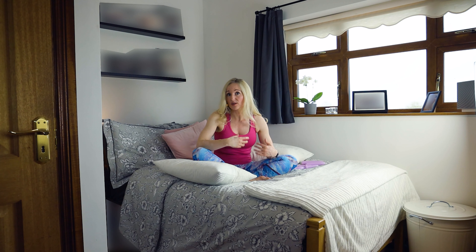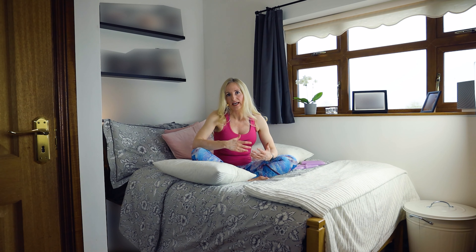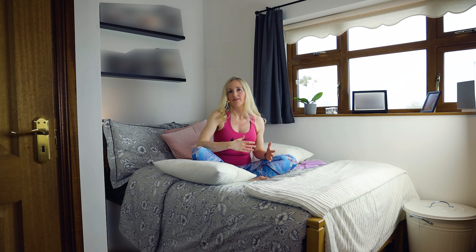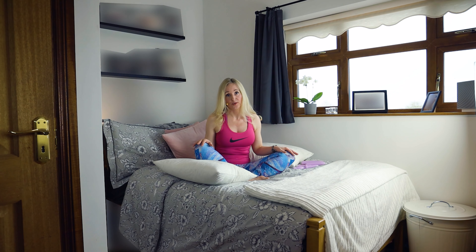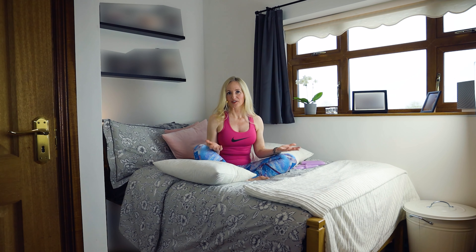Take your time. Be as relaxed as possible. If you want to try penetration, make sure you're with somebody who makes you feel safe and that you're in the headspace for it. If there's a lot of fear, fear communicates to the nervous system — your nervous system cannot tell the difference between what you're thinking and reality. So if you are afraid, your nervous system will sense that. Try to relax, find your happy place, and let go of tension. The pillows will help — if you don't have to hold your legs up, that makes a big difference. You can also take side-lying positions if that's easier, but pillows to the side and behind you with a lot of relaxation is what I suggest.